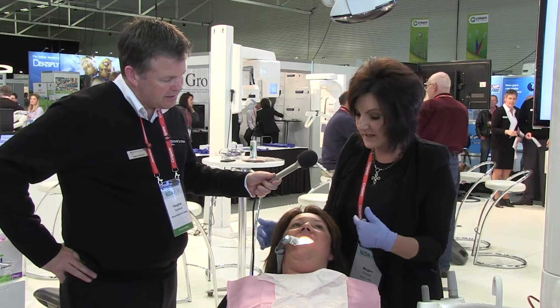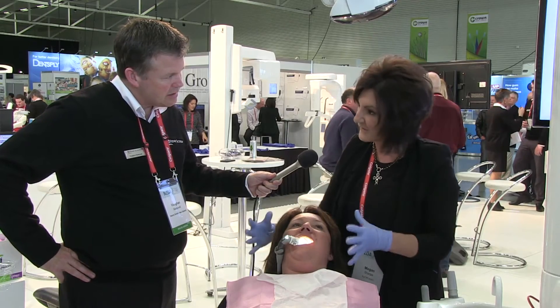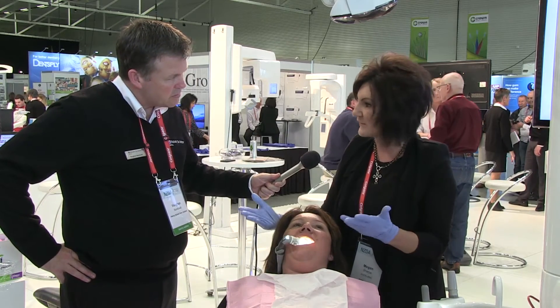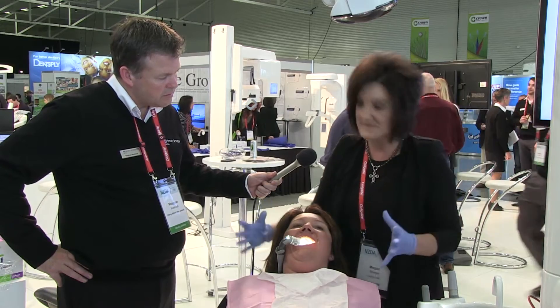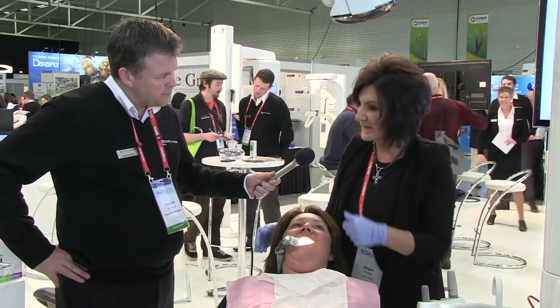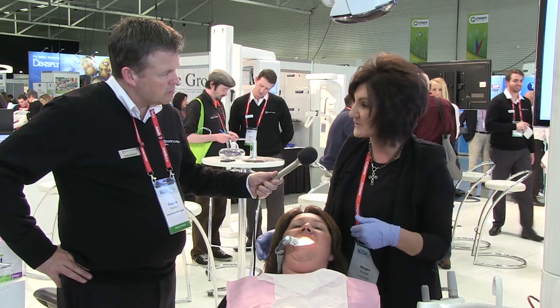Commonly an hour procedure would be reduced by about 10 minutes using a complete evacuation system like this — that's huge when you have a full patient load. Some simple math around whatever your hourly rate is to save that time. The investment in the system is one thing, but the disposable mouthpiece at $3.90 per piece is a considerable saving in terms of ongoing treatment.